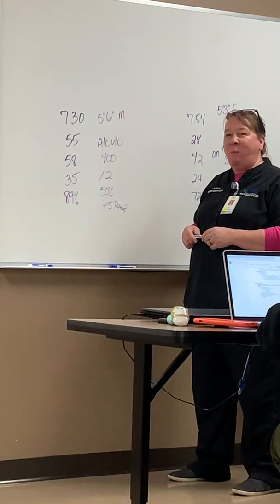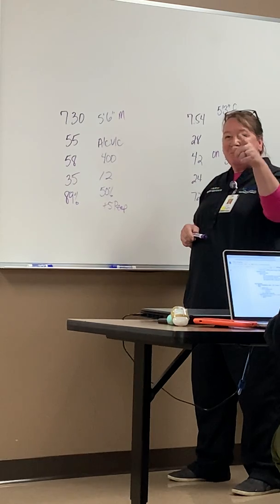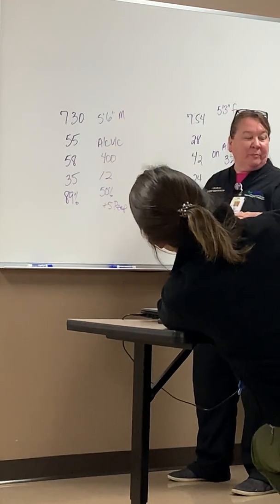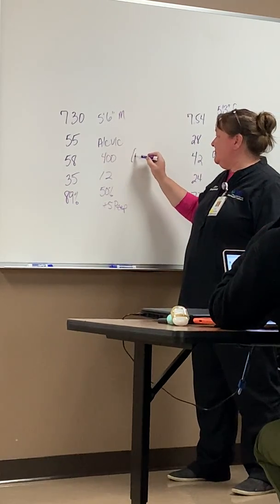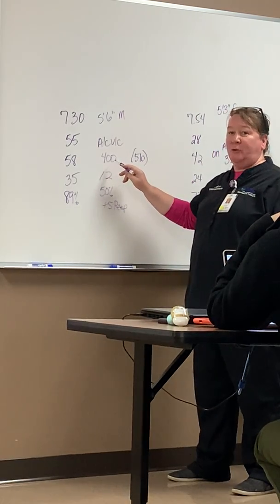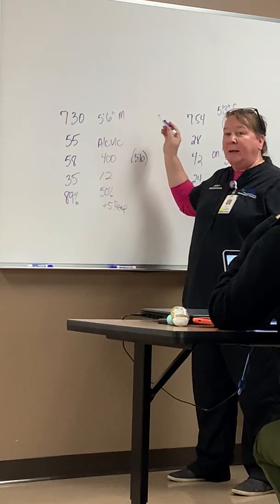Sorry, it's 6 to 8 mL per kg. Robbie, so he's cool to go up to like 510 max. Is it okay to max him out before you start moving respiratory rate? You might, but he's got plenty of room to move is my point. So you go up on volume, the end.